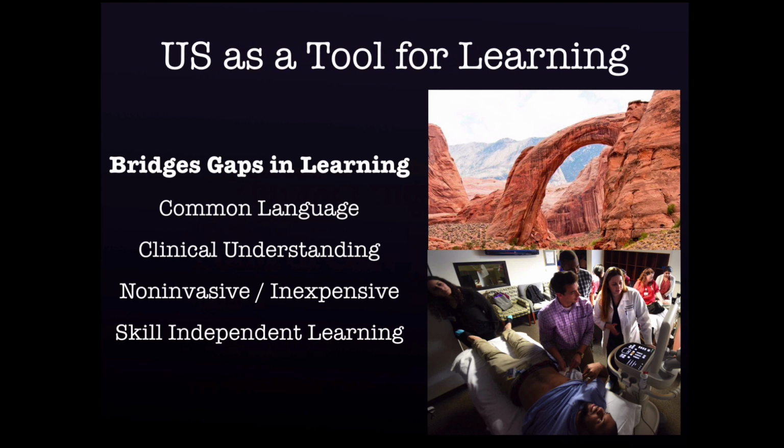So when I say, all right, everybody put your hand on your kidney, some of y'all will not put it on your kidney, which is underneath your ribs and your back. Some of you will put it down on the side, and that's not where your kidney is. And so with ultrasound, I can help refresh those things in you so that it helps you when you're talking to patients about pyelonephritis or kidney stones.